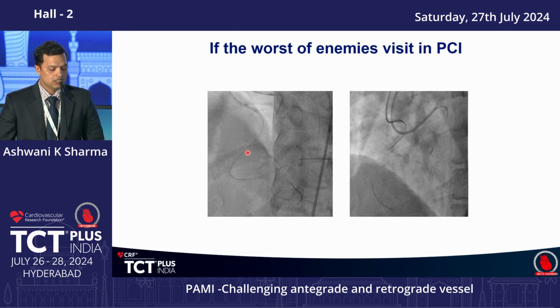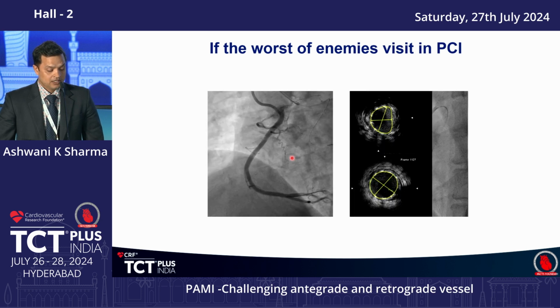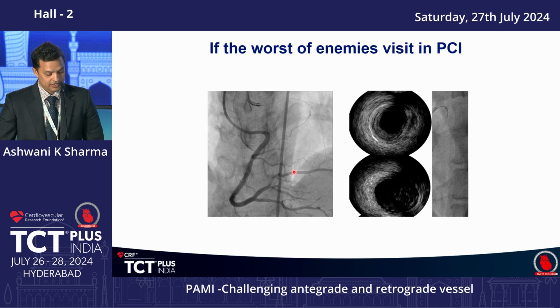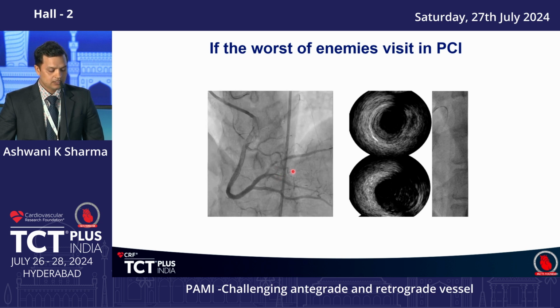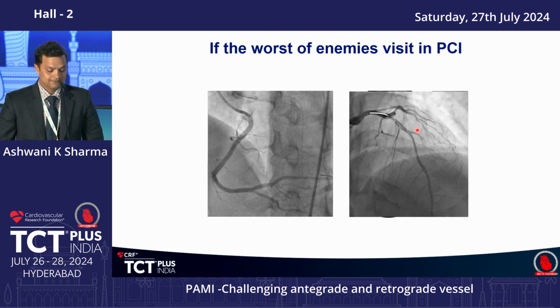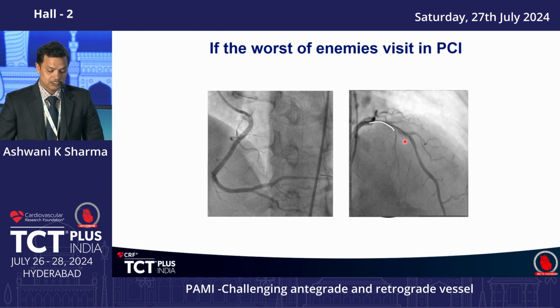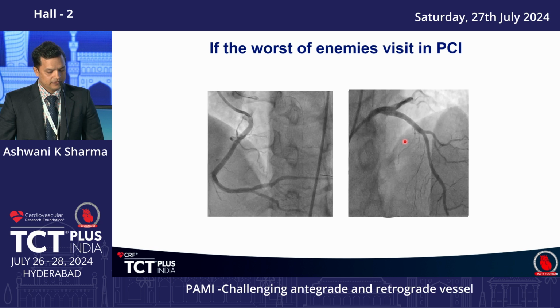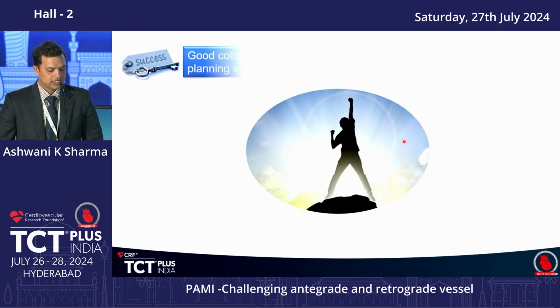Predilatation could be performed with the help of buddy wire only, and the stent was under-expanded. There was disease in the PLVB. The anatomy was very well made out by the IVUS, as well as the optimization of the stent which was placed here. Then the IVUS helped in the assessment of the LAD lesion. Crossing into the first septal was not possible, even after dilatation. Finally, the stenting was done, and good angiographic as well as intravascular outcome was obtained in the given case.